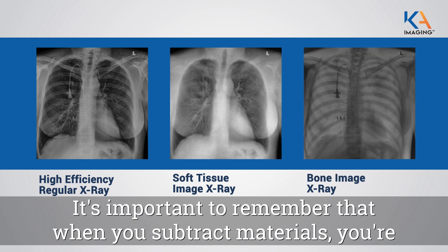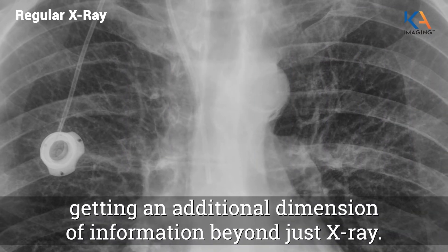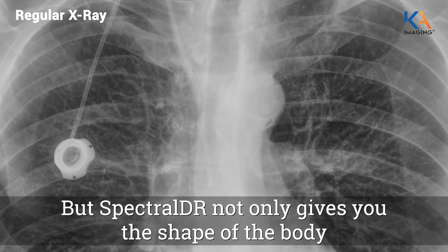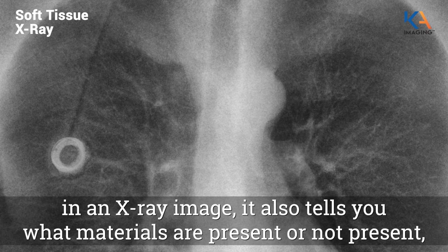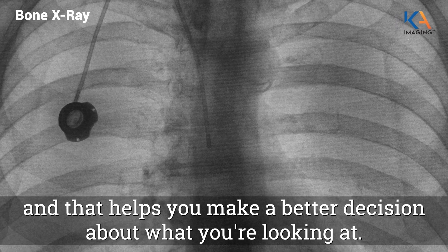It's important to remember that when you subtract materials, you're getting an additional dimension of information beyond just x-ray. You see, x-ray just gives you the shape, but Spectral DR not only gives you the shape of the body in an x-ray image — it also tells you what materials are present or not present, and that helps you make a better decision about what you're looking at.